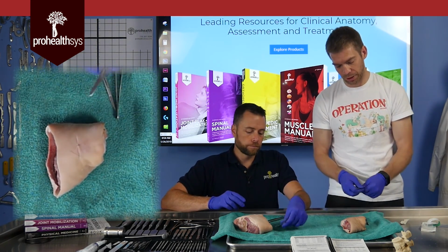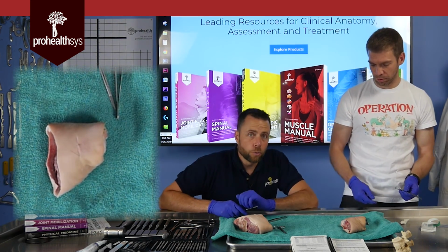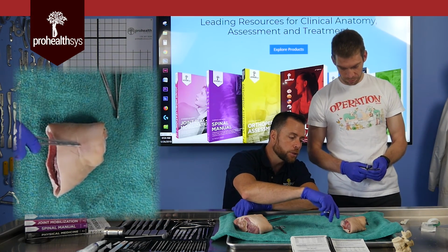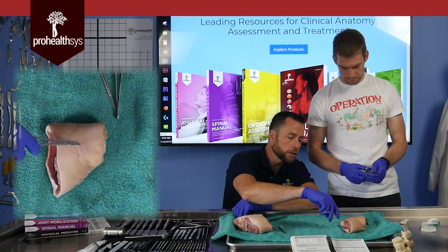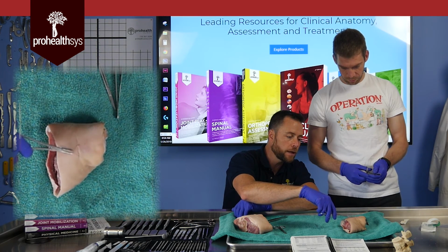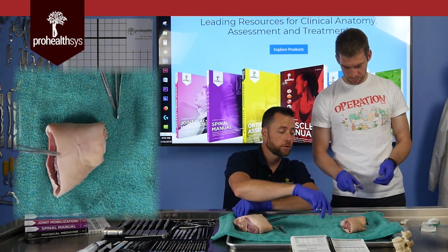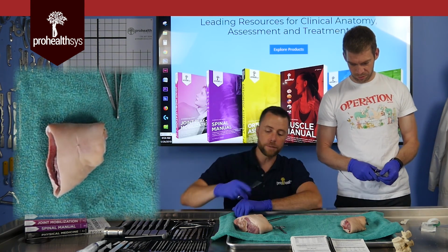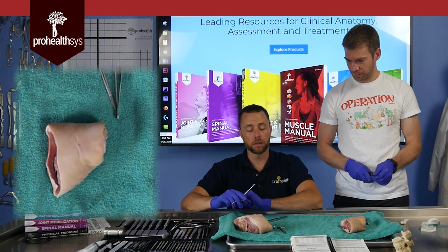How do I know if this knot's okay? Dr. Vizniak's going to test my knot. When I was in school and we were teaching this, typically we'd pull on the edges of the knot, pull on the threads, and see if you can take it apart. This is a fantastic knot, and in fact, we should get rid of these. I dock him a few marks for leaving his fibers out here. Otherwise it's fantastic. Really good knot. That 4 loop over really gets it locked in place.